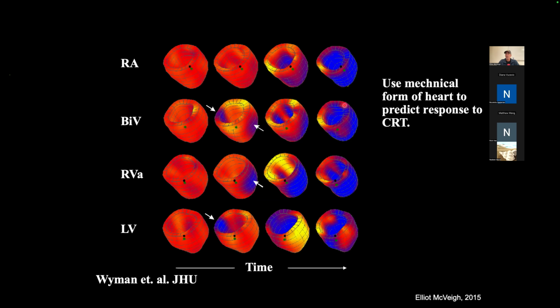This biventricular pacing is called CRT, or cardiac resynchronization therapy. And that's for patients who naturally have this going on without providing it with a pacing lead. Just their heart is contracting early on the septal side. And so what we do is we put a lead up here and turn this into this, right?